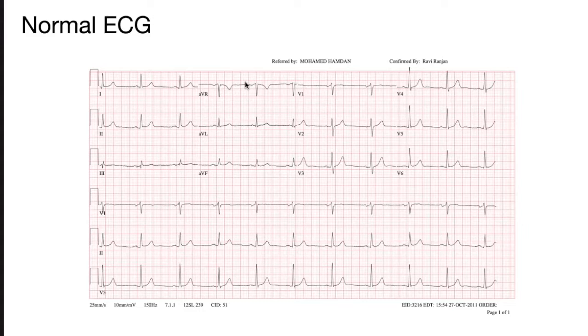For this example, I would just pick one beat. We don't need to do any fancy averaging. So, Lindsay, do you have any idea of how we go about doing this? I'm forgetting the actual name, but you would look at the same point on each cycle and how many boxes it spans. Yeah, because then we could do rate over it was 25 millimeters.